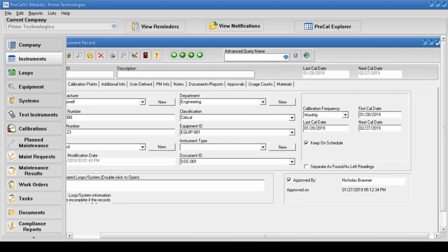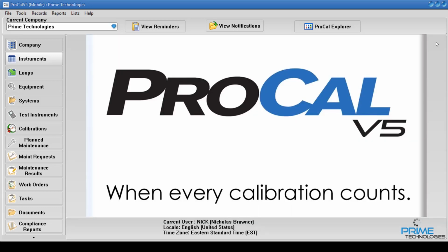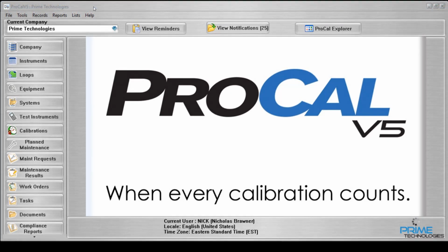Employee record screens access will be limited to system administrators and solely for the purpose of re-enabling users and resetting passwords for temporary use on the mobile workstation. You will not have access to user-defined variables, user-defined labels, user-defined lists, or the required field screen. Once the user has completed their work on the mobile workstation, it may be imported back into the production database.